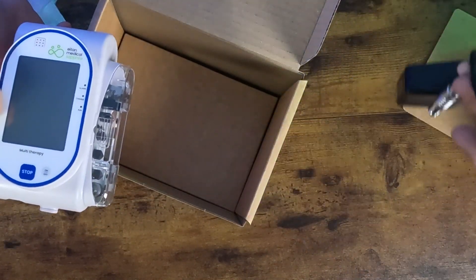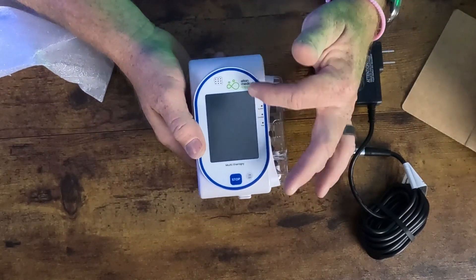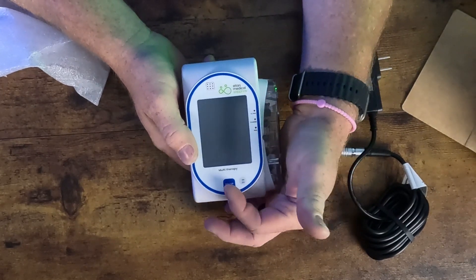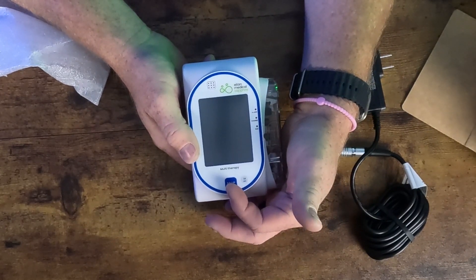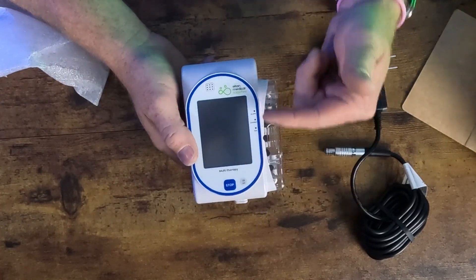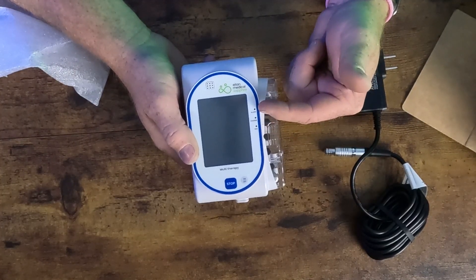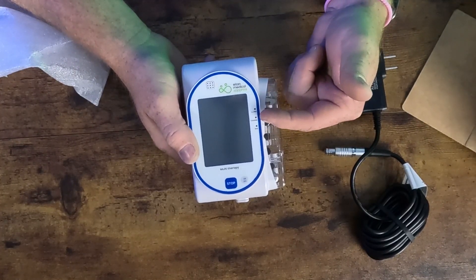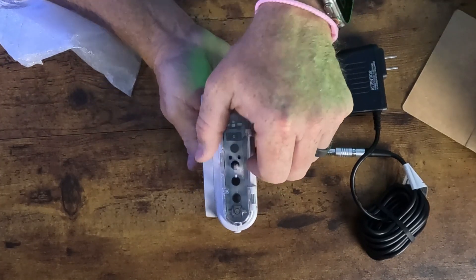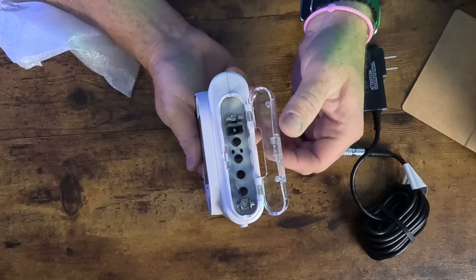A quick overview of the pump: it's a pressure-sensitive touchscreen — not like a cell phone sensing heat, this is a pressure screen. There are two buttons on the face of the pump: the stop button stops an infusion at any time, and the power button powers the device on and off. Three LED lights on the right side — an alarm light that illuminates when there's an active alarm, a charge indicator, and a run light that illuminates green.